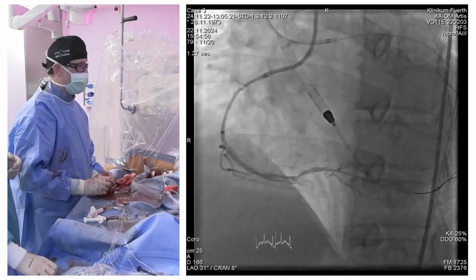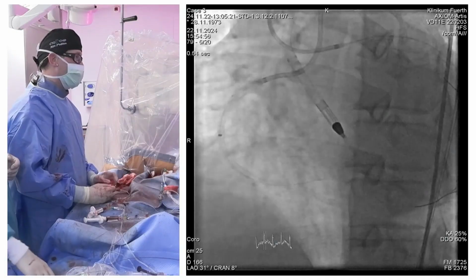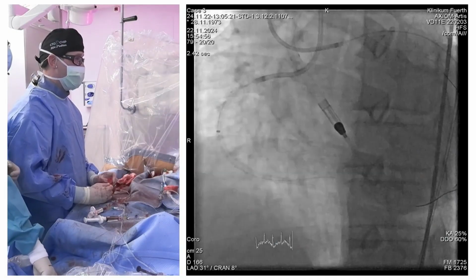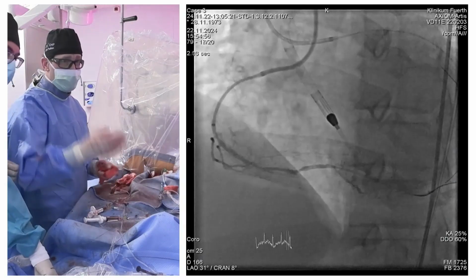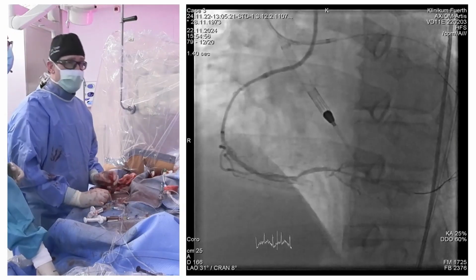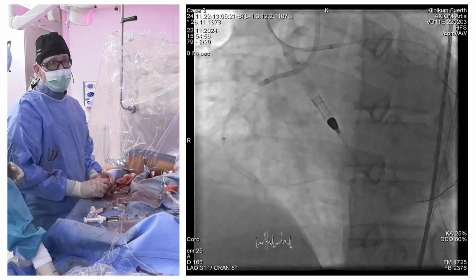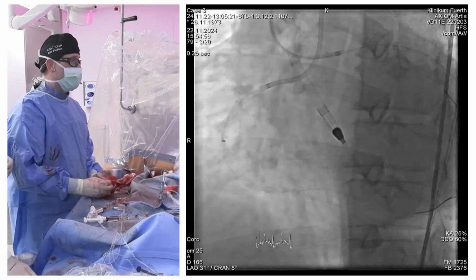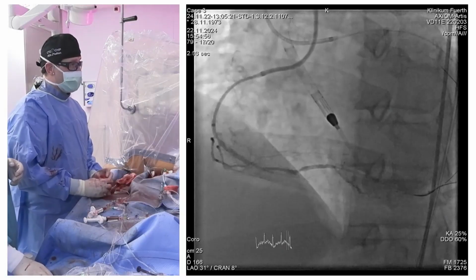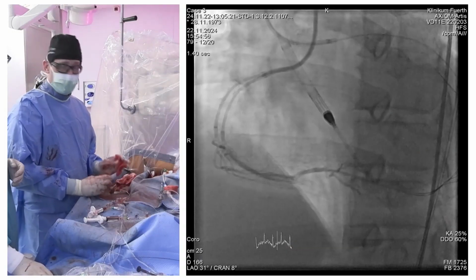So what we're going to try to do now is we're going to try to puncture the PD, trying to preserve the PD, and then dilate ourselves up with high pressures, maybe with IVL, do another IVUS imaging. You have seen it's very beautiful, and this was only the half speed, so you can do a 10 millimeter per second speed, then you have the full vessel in more or less 10 seconds. And yeah, then we're gonna decide if everything opens up well and stays open. We probably just go and DCB the whole thing.